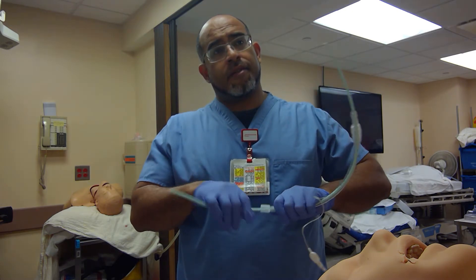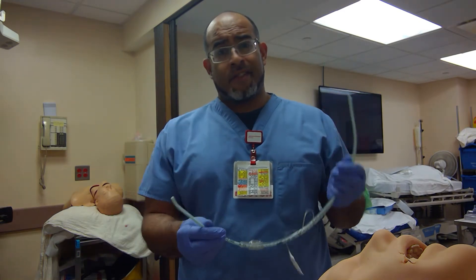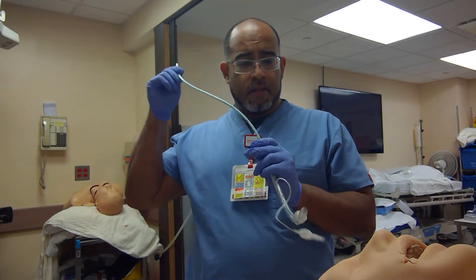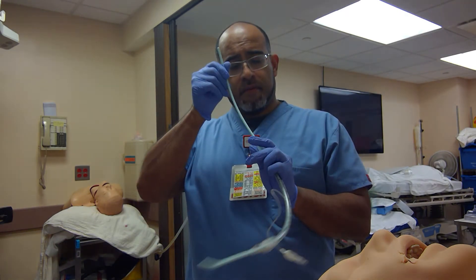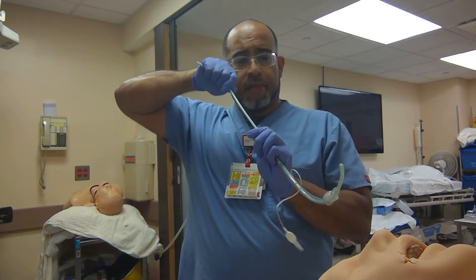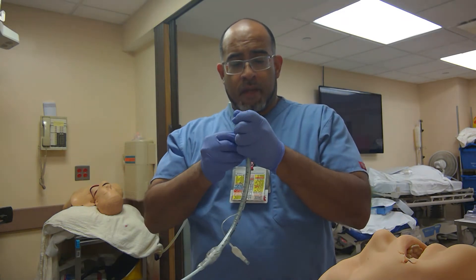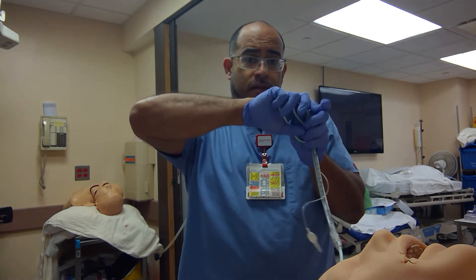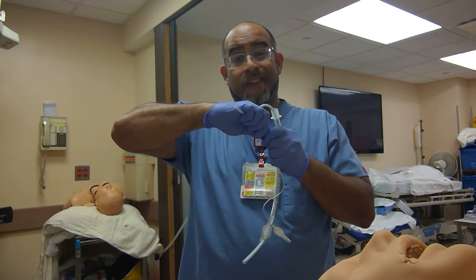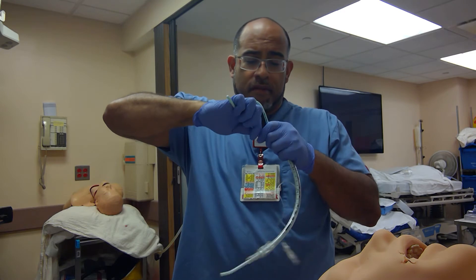There's one technique that I saw a doctor and nurse anesthetist in shock trauma in Maryland use — the Bonju method. Basically, use the bougie and instead of a D-grip, actually bend it to an angle so you can bend at the back end and fit the back end into the ET tube.